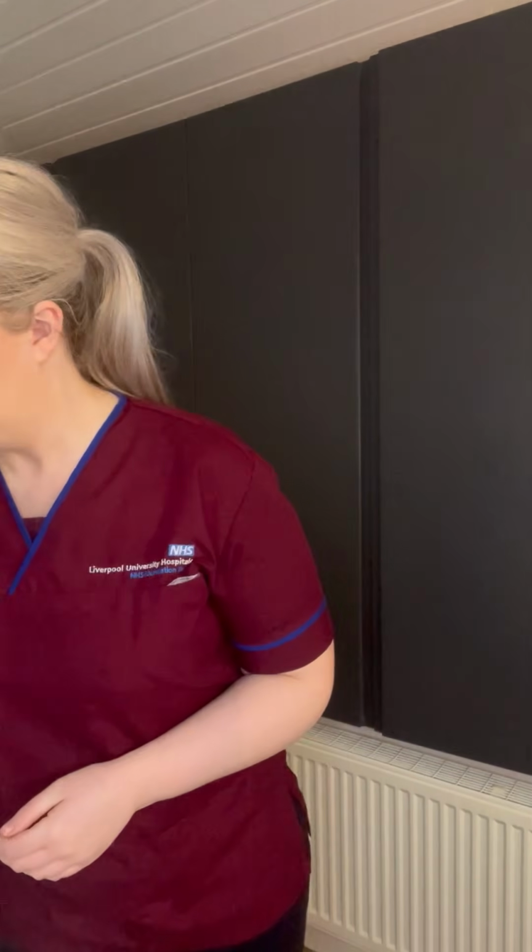So, firstly, we want to identify the correct type of needle. If you're administering insulin to a patient as a third party, safety needles must always be used. Now, on the Aintree site, we use a slightly different safety needle to the Royal and Broad Green site. However, the principles of use are the exact same for them all. On the Aintree site, we use these click start safety needles, and on the Royal site and the Broad Green site, you use micro dot needles.